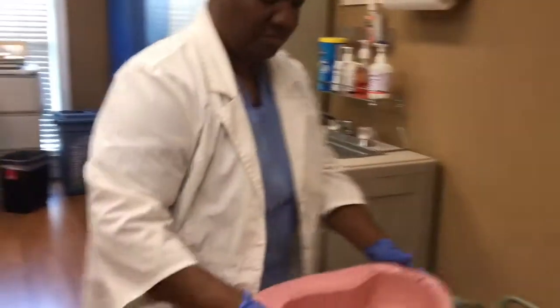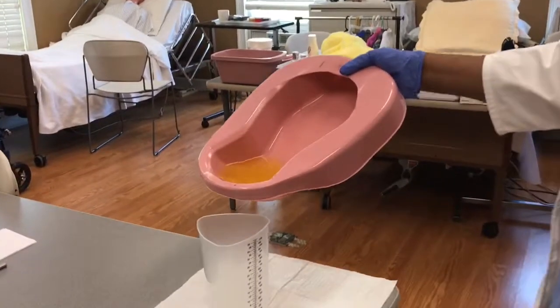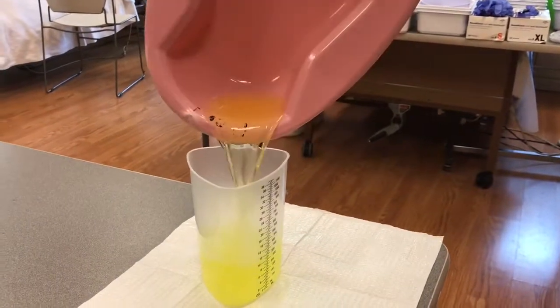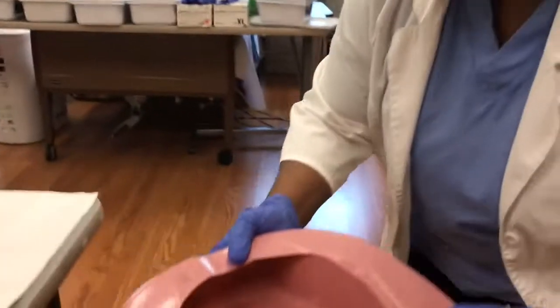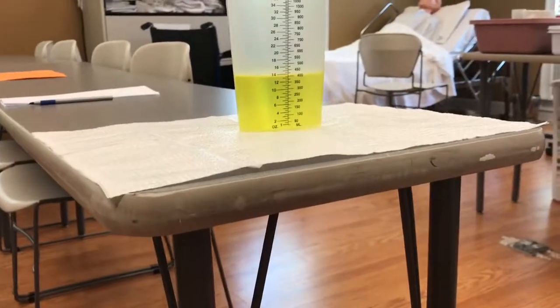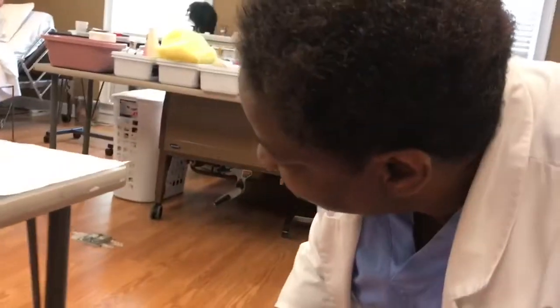I get my urine and I will pour the urine into the measuring container without spilling. I'm going to get down and measure the urine at eye level, and it is 400 ml.